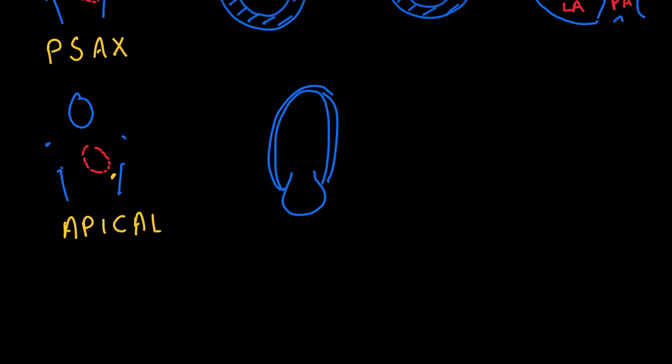Show the muscle there. And then over here, you'll see the right ventricle, and you'll see the right atrium. So over here, just label these: left atrium, mitral valve, left ventricle, right atrium. I'm going to use a different color for the tricuspid valve leaflets. Tricuspid valve and right ventricle.